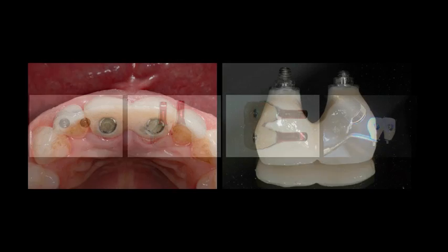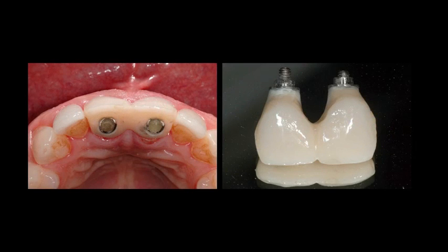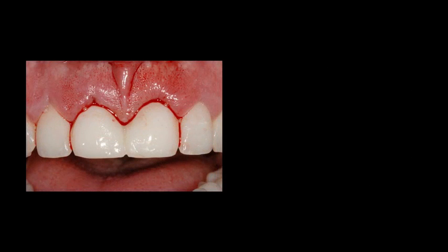composite. And then we contoured this to have a fairly flat emergence profile. I wanted to support the tissue without putting a lot of pressure on it initially. We can always put pressure on it later when the whole thing is osseointegrated. So here it is immediately post-surgery.